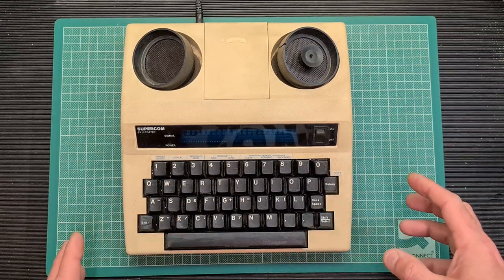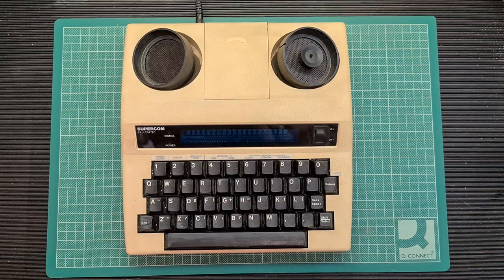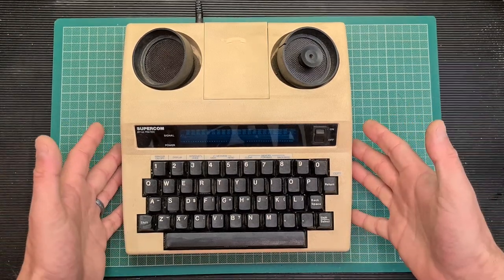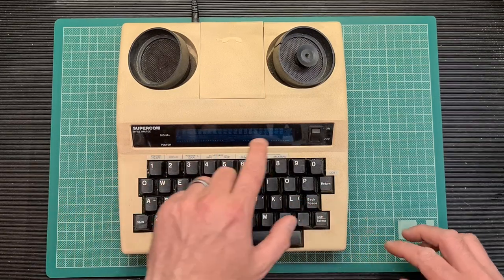In this video I'll take you through it, have a look at the device, talk about how it works and then actually do a demonstration of it working. So as you can see the device looks fairly simple — we have a keyboard, we have a nice VFD, a vacuum fluorescent display to display the data, and we have an audio coupler.